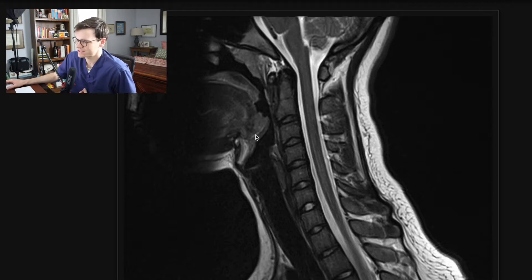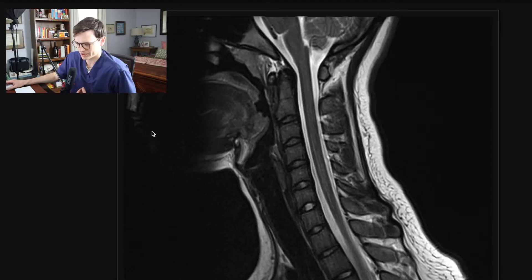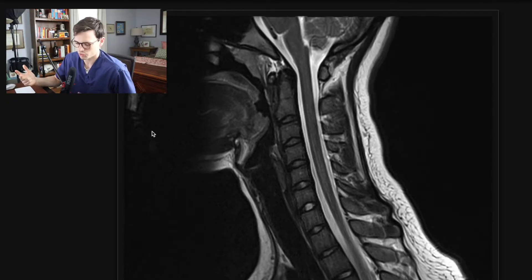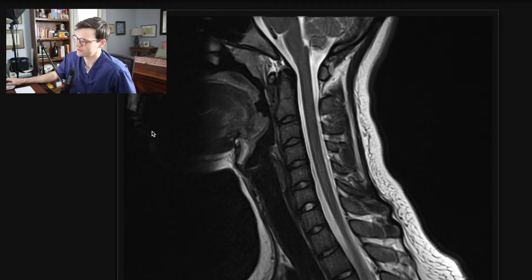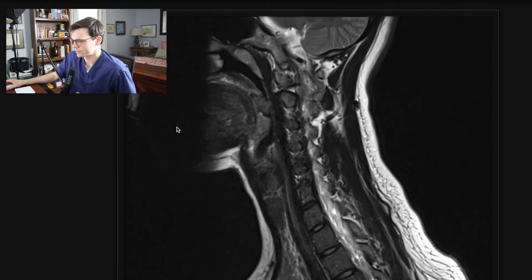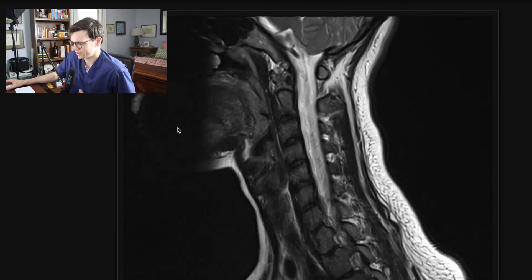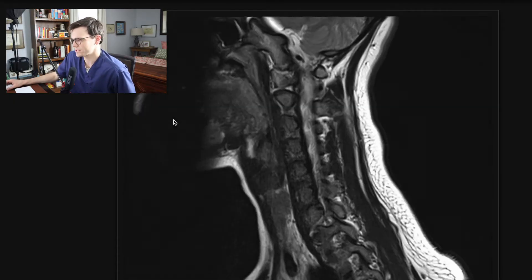What I have here pulled up now is the T2. T2 is the good sequence for really looking at the cord. There are different causes of cord signal abnormality. The major causes to always think about when you see cord signal abnormality are neoplasm, radiation-related change, compression or trauma, and demyelination. That's a good place to start with your differential diagnosis. The T2 is a really good sequence to look at the cord — I'm going through looking at the cord now. In this case, this is a normal cord, so I don't see any significant cord signal abnormality.